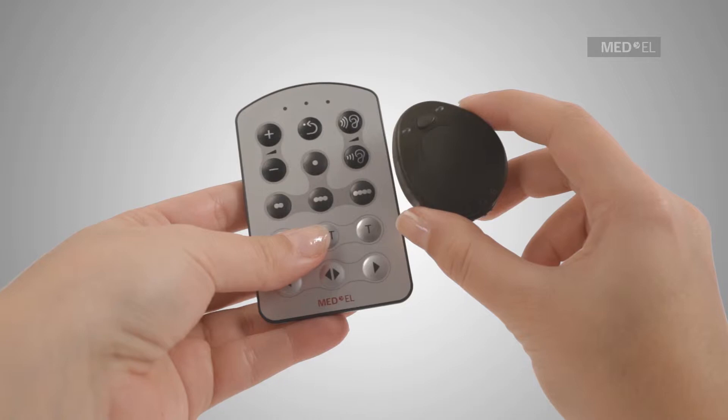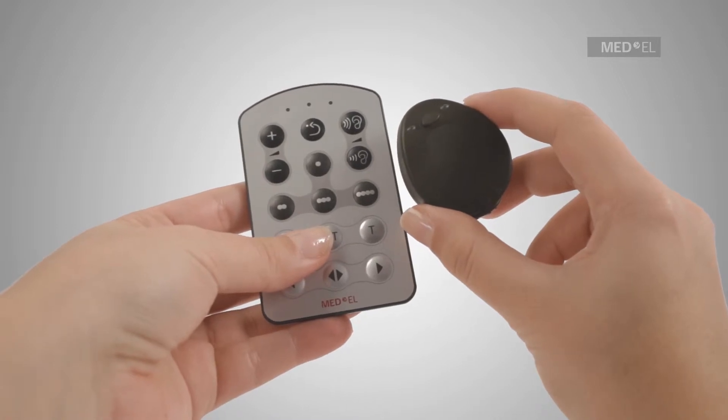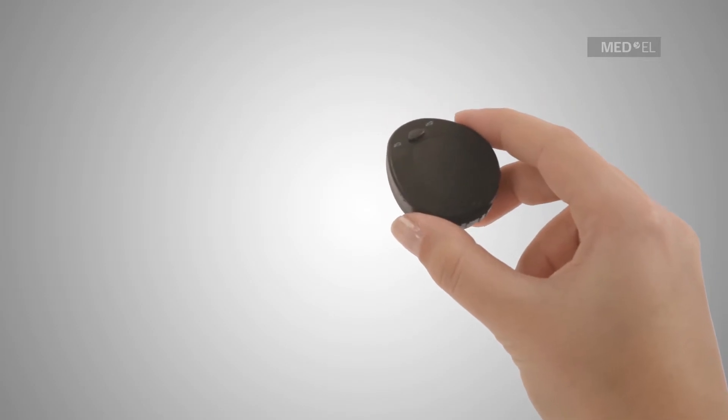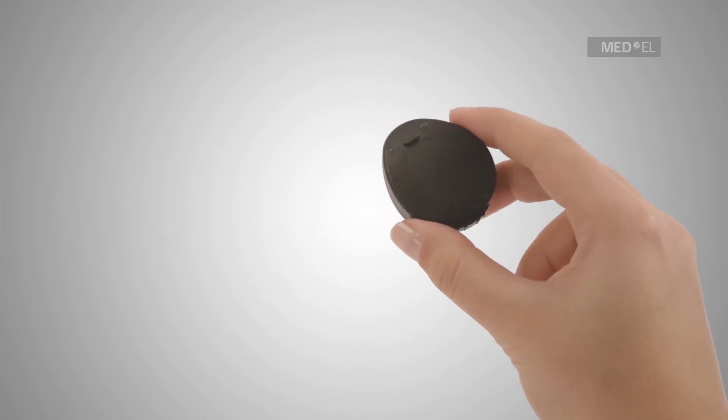Your clinician or audiologist will configure the FineTuner to suit your needs. Sometimes it may be necessary to sync the FineTuner with the audio processor.